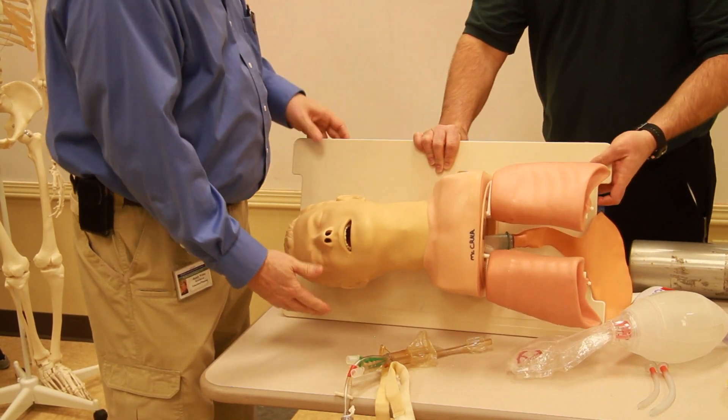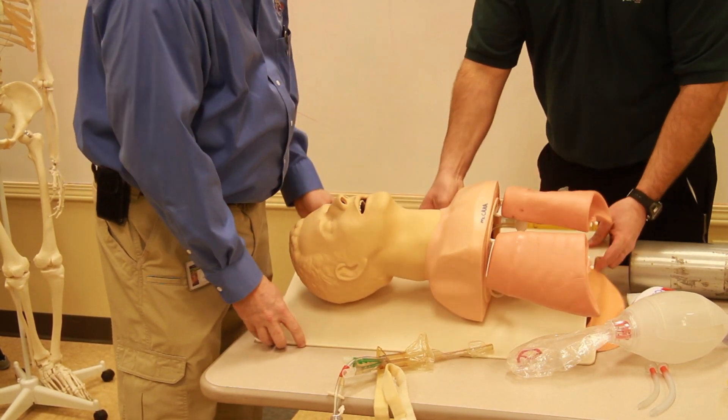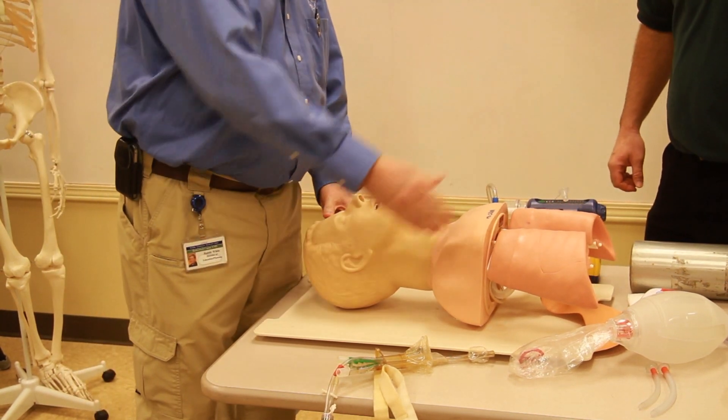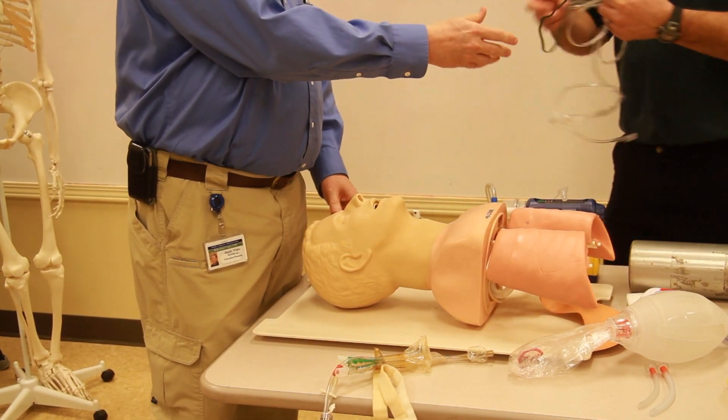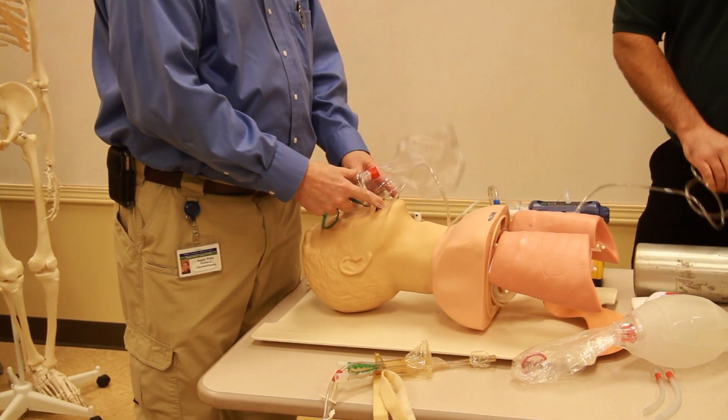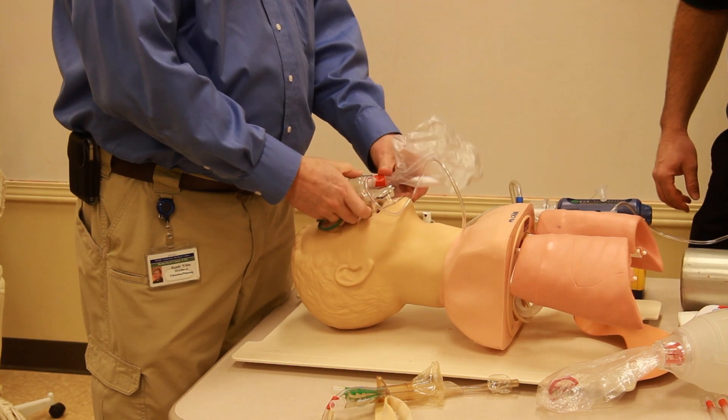Two — three — out comes the airway, then suction, suction, suction. We place the patient in the left-side recovery position, or on their back depending on other clinical concerns, and we ensure the patient receives 100% O2 via non-rebreather mask.